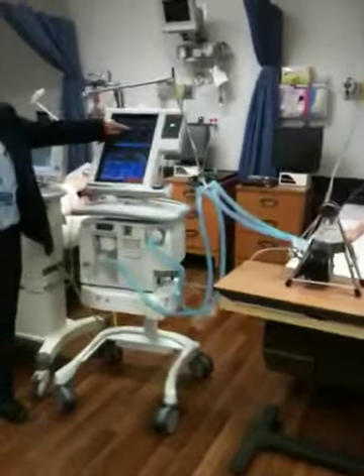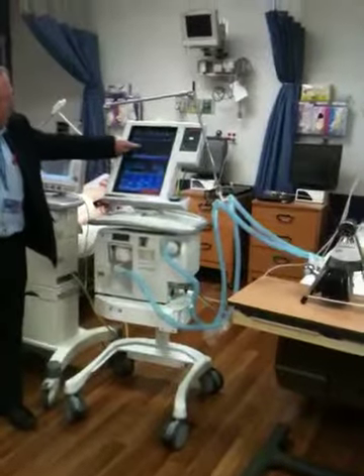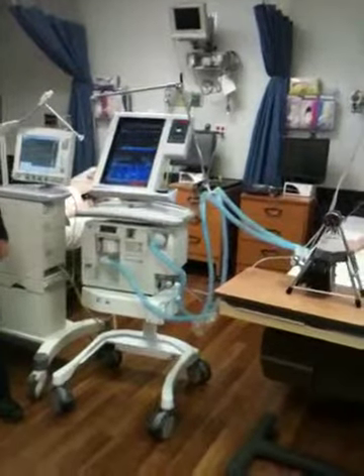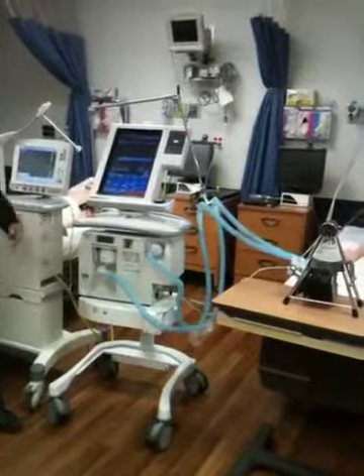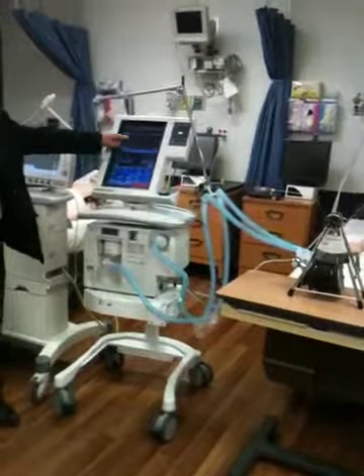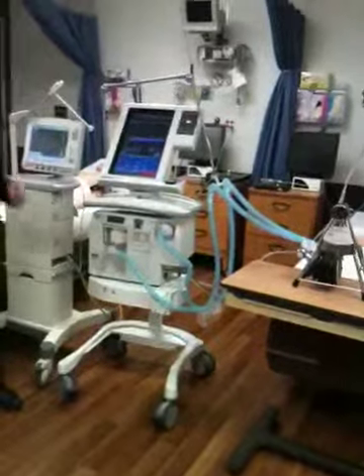This is a machine cycling. This is the patient exhaling back again. It should be a nice gradual decline coming back up, so I can look at it and say, okay, I gave him a bronchodilator and his airway resistance went down. It changed the shape of the flow volume curve.